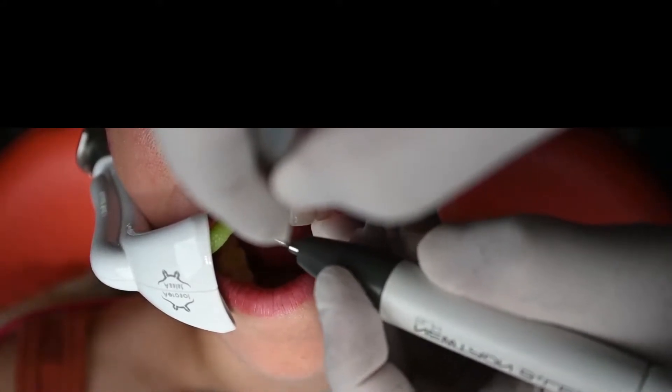For this, we use the piezoscaler from Action and the aerosol assist, which removes intraoral fluids and provides aerosol reduction.